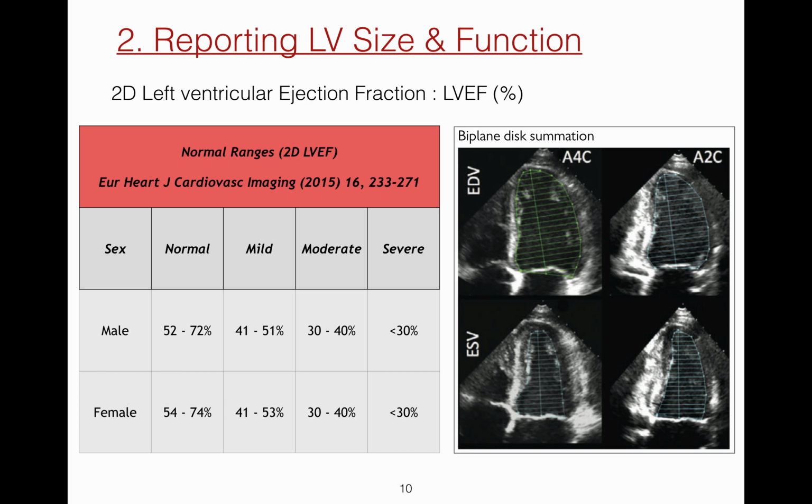The 2D LV ejection fraction reference ranges, which vary slightly according to the patient's sex, are displayed here on this slide.